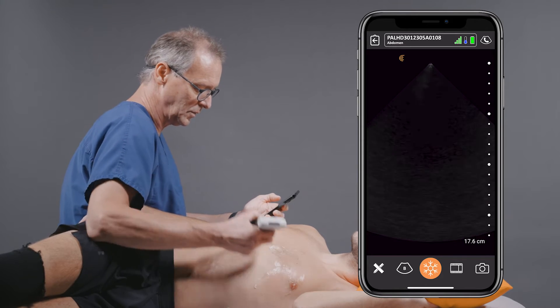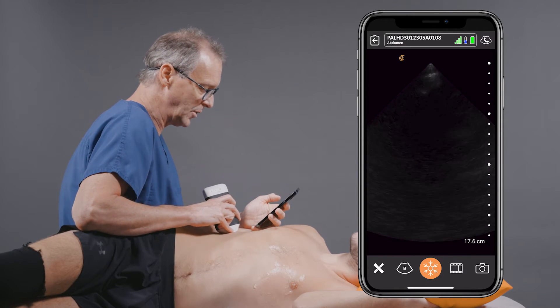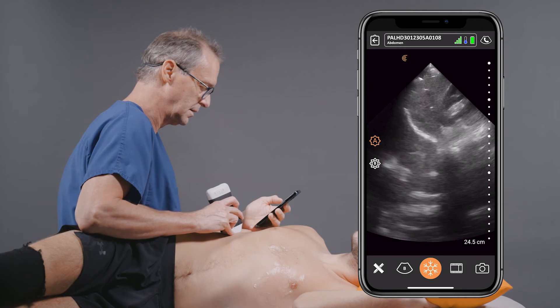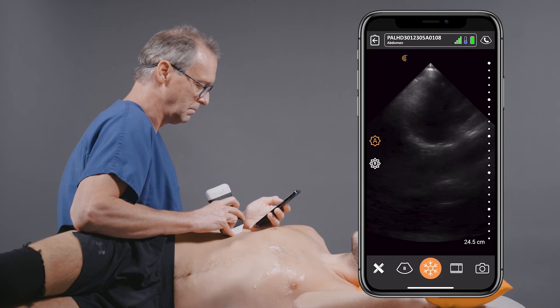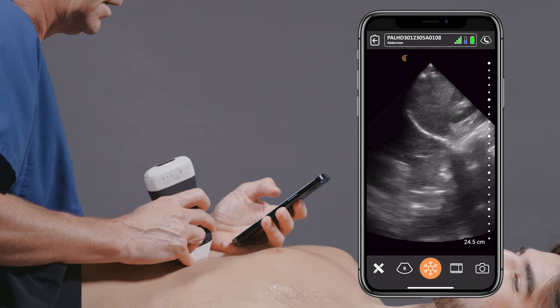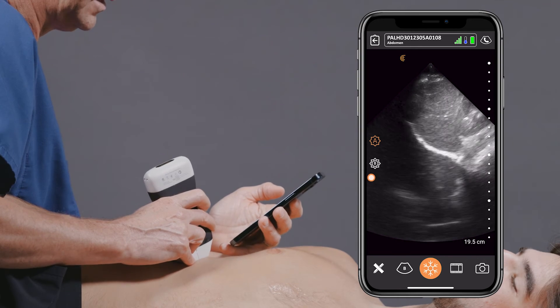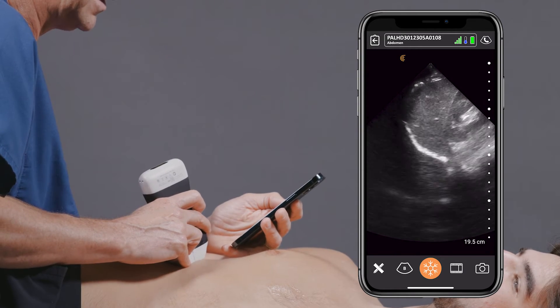Next, we'll take a look at the right upper quadrant. What we'd like to do is look for evidence of free fluid in the right hemithorax. You can see here mirror artifact indicating there's no fluid accumulating in the right hemithorax.